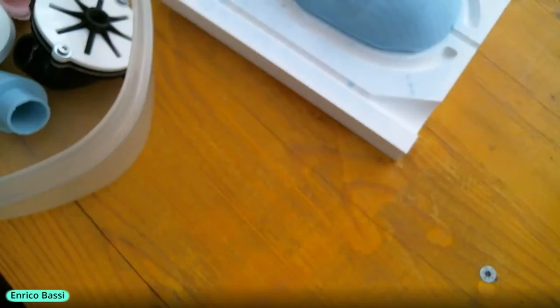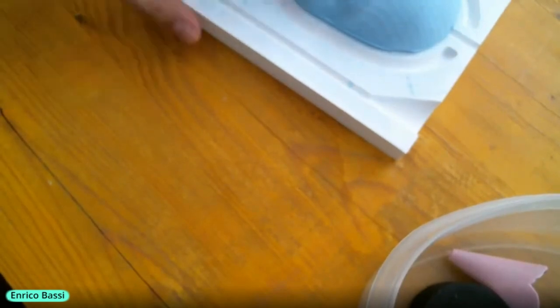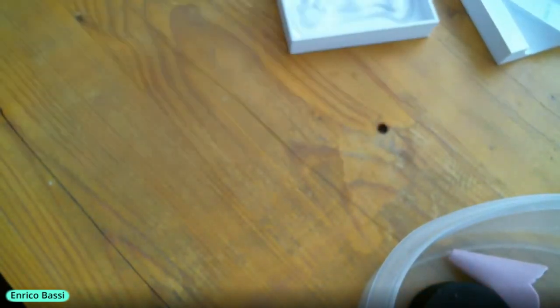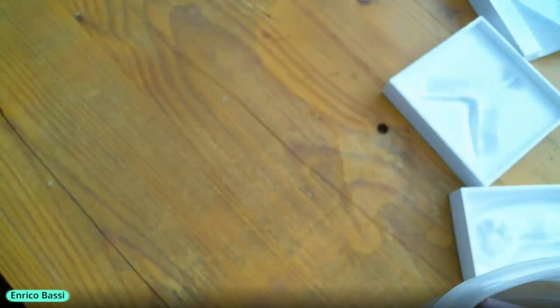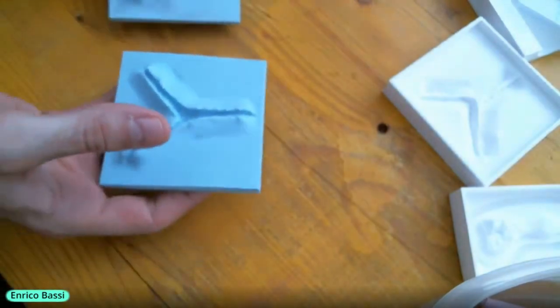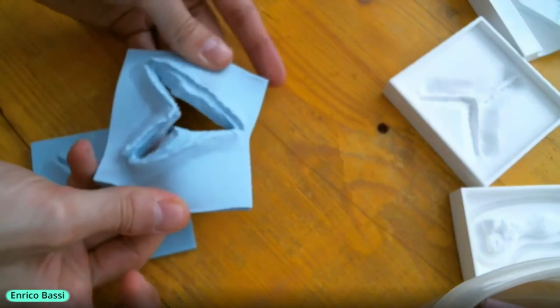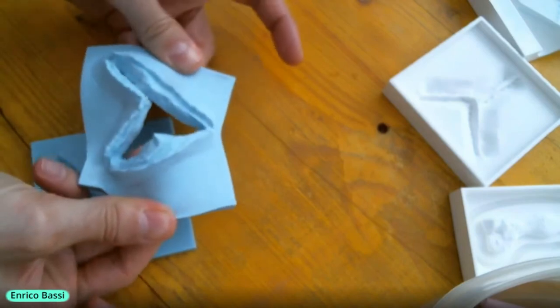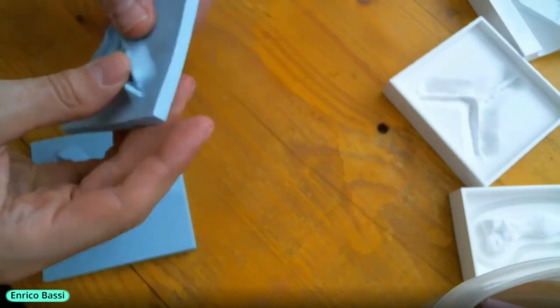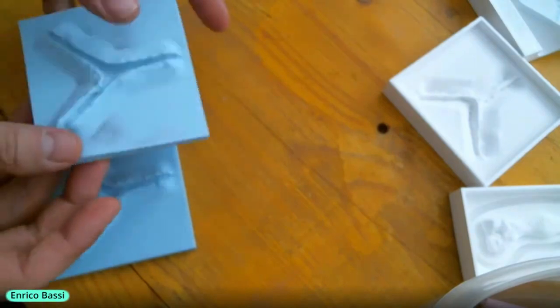Okay, I can show you about the parts, the difference. Let me fill some space on the table. So the difference between embedding a net or not. So in this case, I embed a net and then I rip the thing, and you see that over where the net is, it is not ripping over. So I'm pulling pretty hard. Of course, nothing is indestructible, but it makes things much more robust.